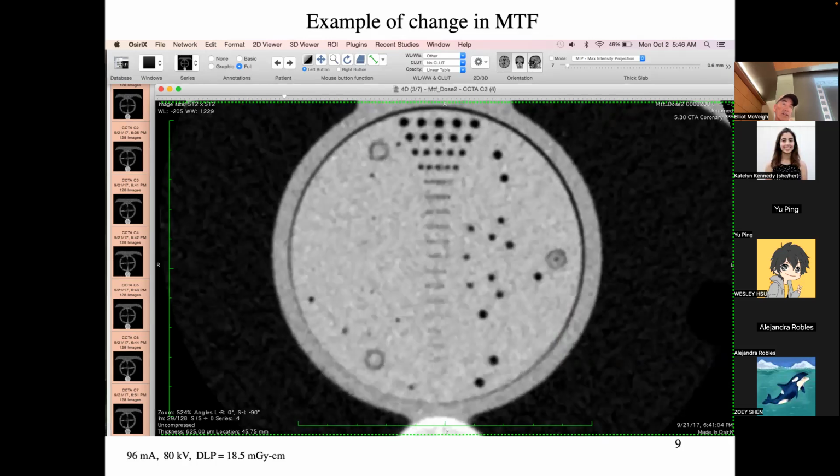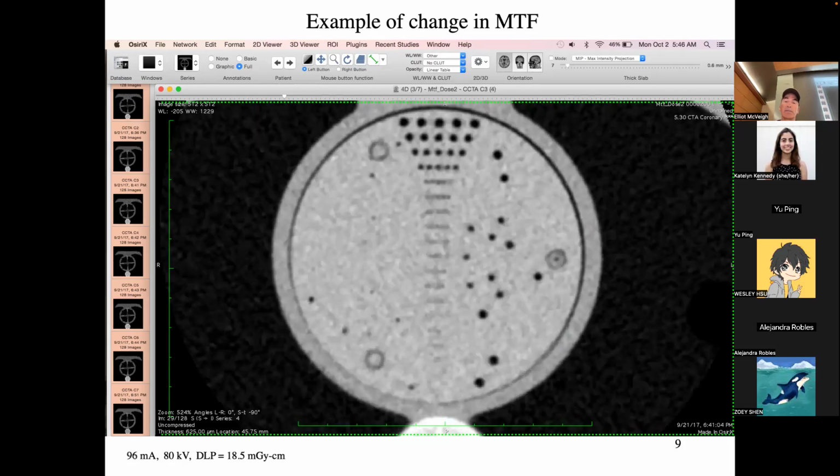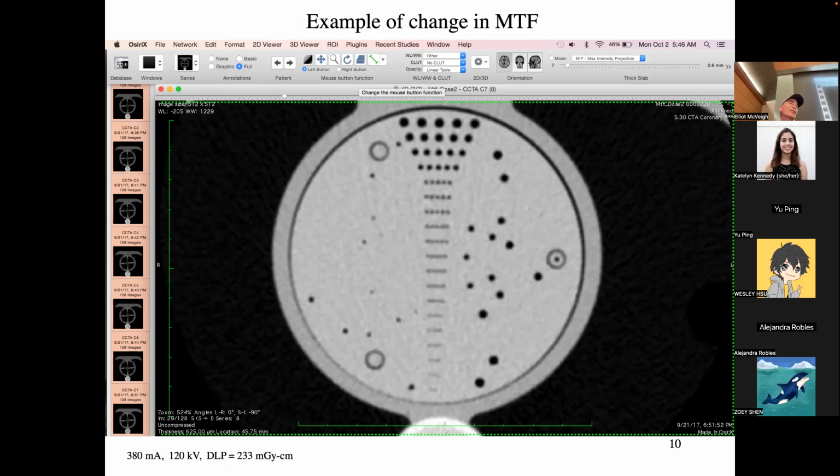Okay, so first, this picture is with fewer photons, and then I crank photons up, I get this picture. So you can see now I can start to resolve more things there, and I can measure which ones I can resolve, and that tells me my modulation transfer function under those two conditions, right? And the reason that the spatial resolution gets better when you use more photons is inside the reconstruction algorithm, the vendor doesn't have to average stuff together to make the signal to noise at all rational, right? When we're making this picture in the raw data, there are so few photons, they start averaging things in space on the detectors, and that blurs the picture. And then you get there and it sharpens it up some more.